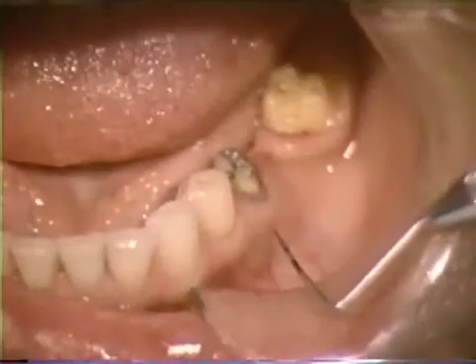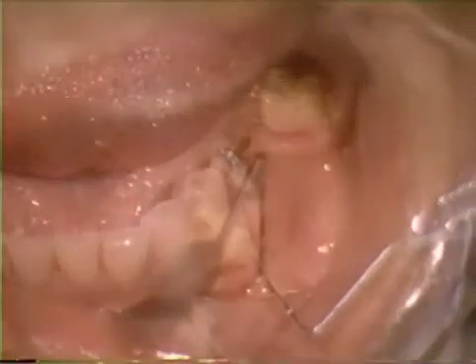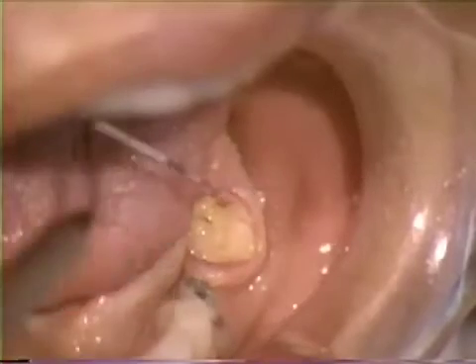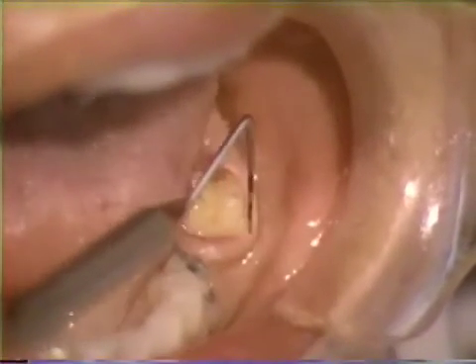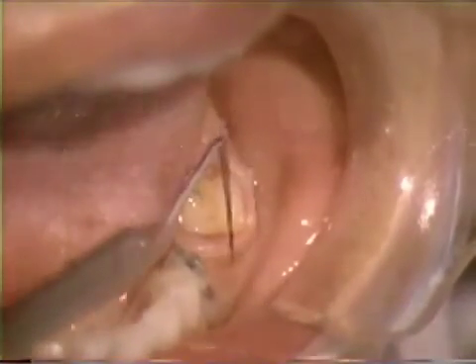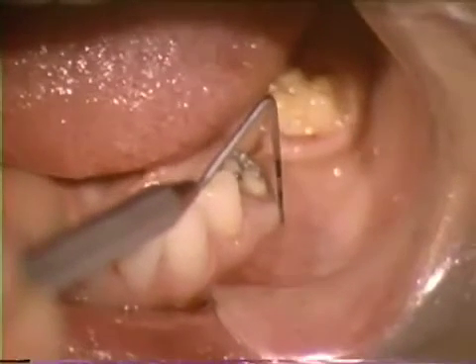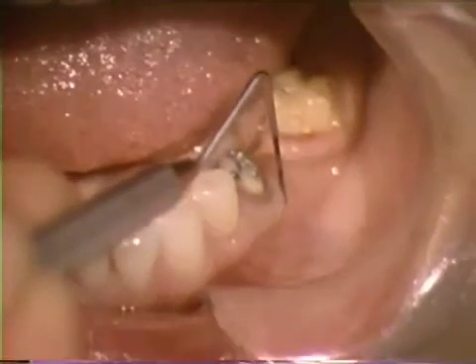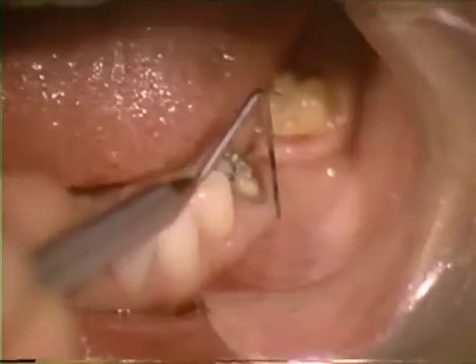A periodontal probe is used to measure the pocket depths and the width of attached tissue. Attached tissue width is an important consideration, since a mucogingival defect would be created by removing too much tissue. With this particular patient, enough attached tissue is present around the second bicuspid and molar to allow a gingivectomy-type procedure to be performed.